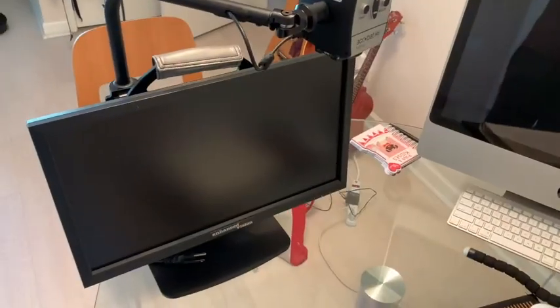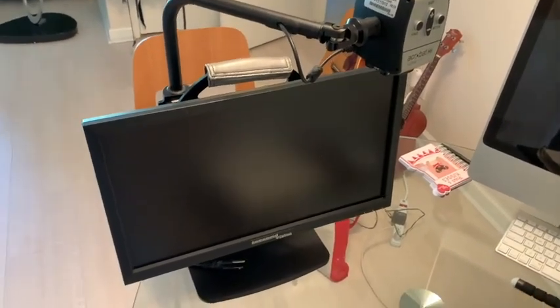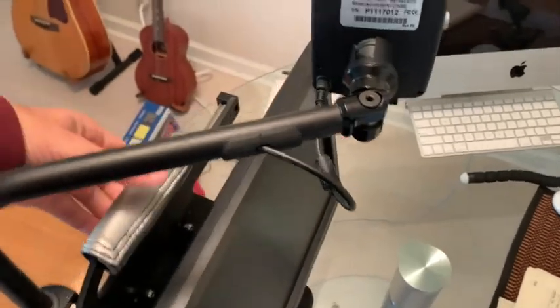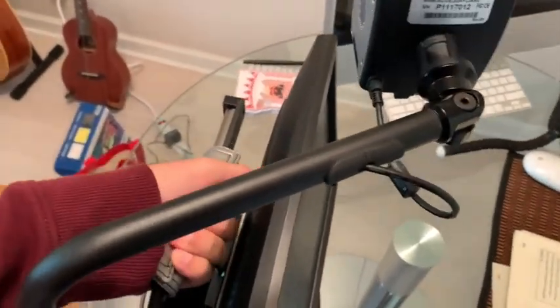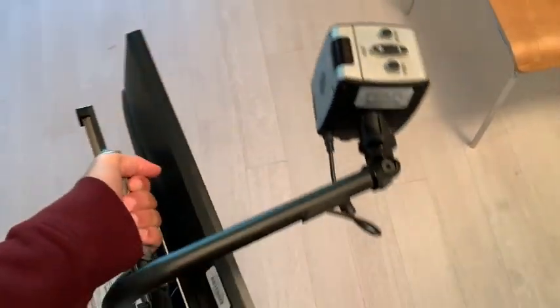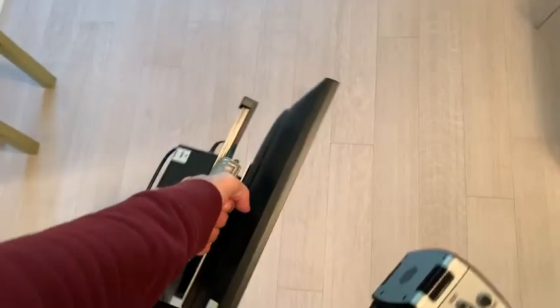The other thing I like about this Acrobat is it's pretty portable. When it's unplugged and ready to move, it has a little handle here, and it's really not that heavy. If you just need to move it from one room to the other, it's not a big deal.